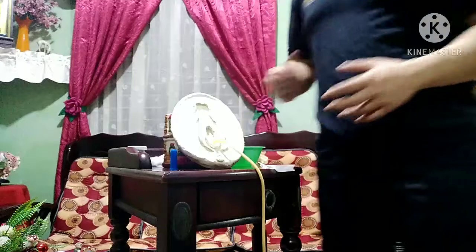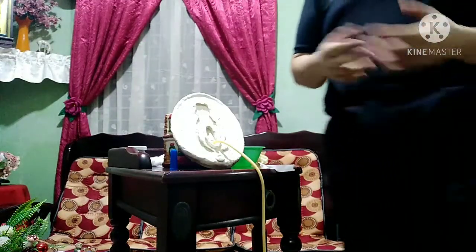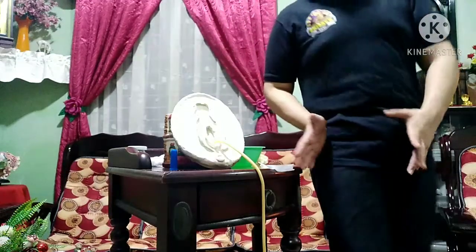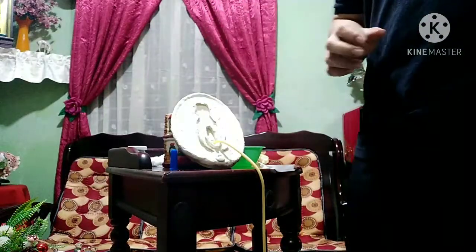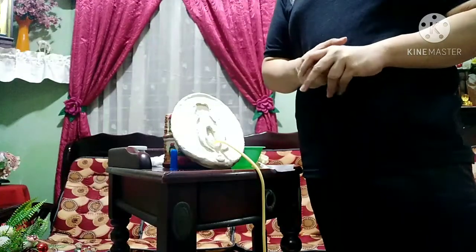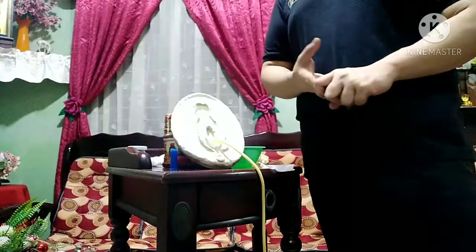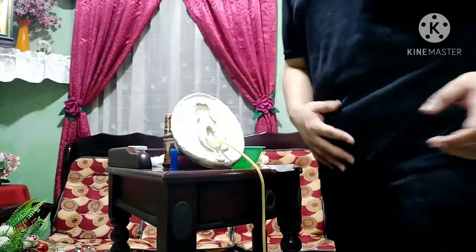So, ayan po. So, step 28 po, documents the procedure using FDAR po. So, lahat po ng naging procedure natin all throughout po kay sa patient po, i-record po natin siya. And then, step 29, maintains body mechanics throughout the performance of the procedure. And lastly po, step 30, show calmness while performing the procedure po. So, ayun po. Thank you po.